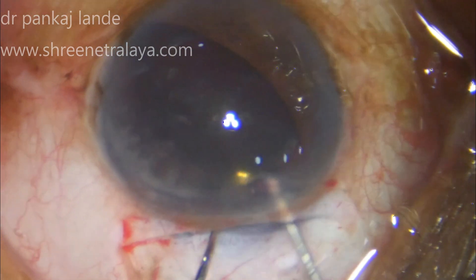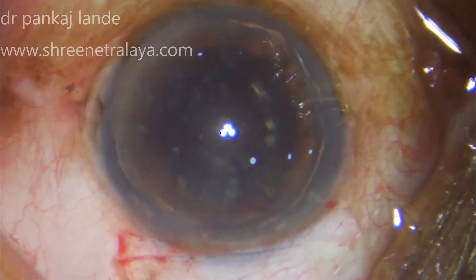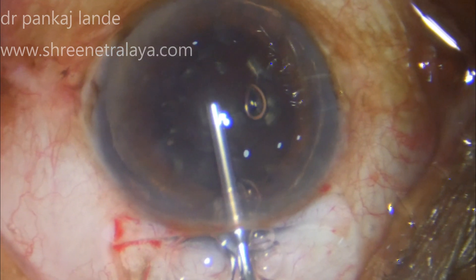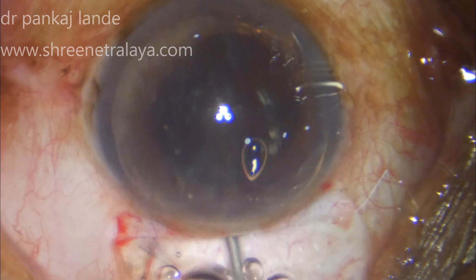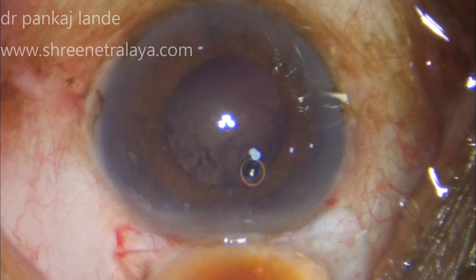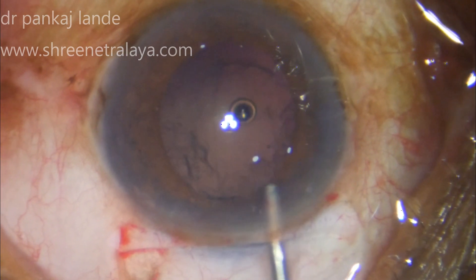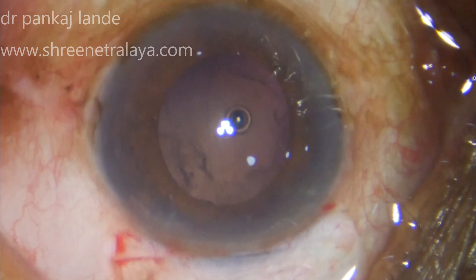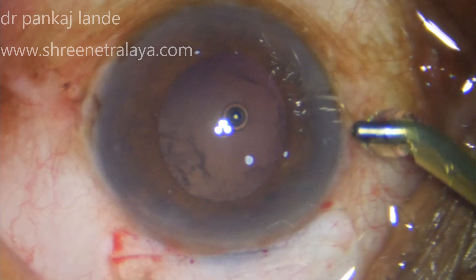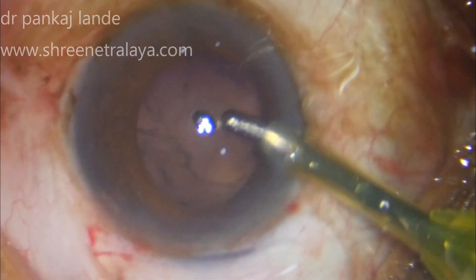I have pushed the nucleus slightly down and supported the nucleus equator with my left hand, then rotated it with the right hand so that in a stepwise manner it comes out of the bag. Once that is done, I inject viscoelastic below the endothelium and the nucleus is viscoexpressed out.